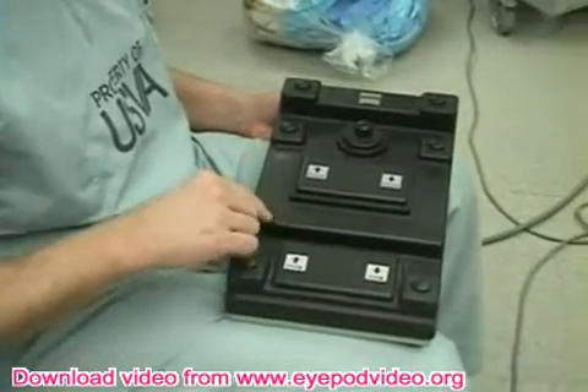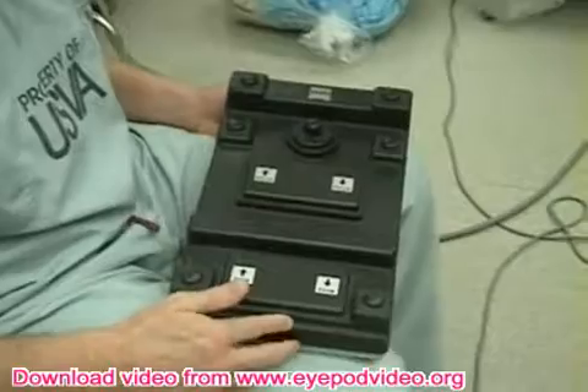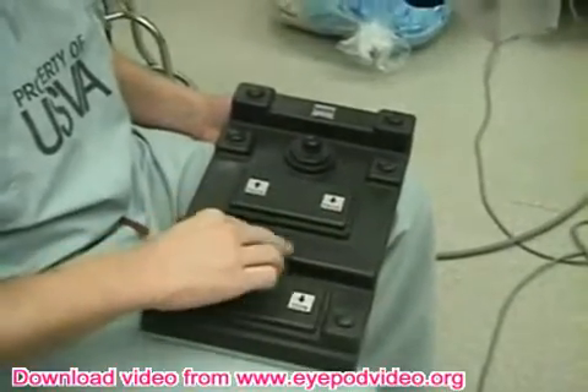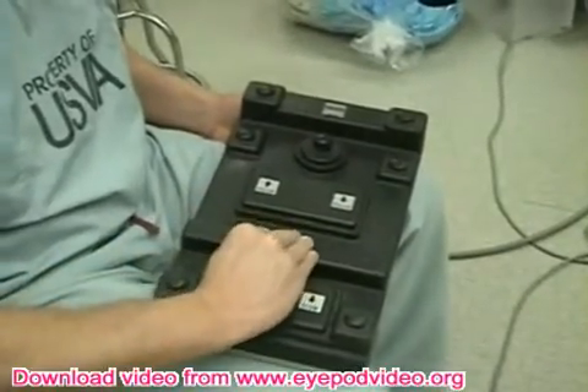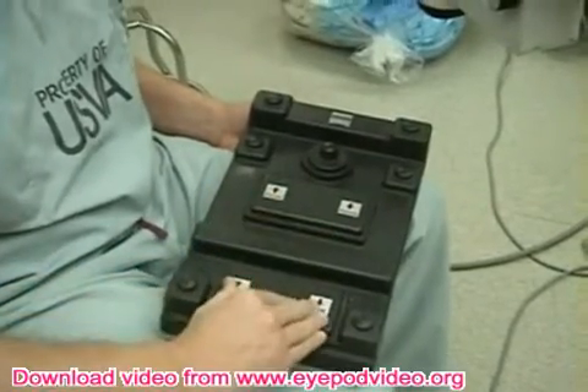We're going to talk about the microscope foot pedal. They're all very similar — the ones at the University are very similar to this one, which is at the VA. There's usually a bar, and on this bar is where most people rest the ball of their foot. In front of the bar is usually the focus, and behind the bar is usually the zoom.